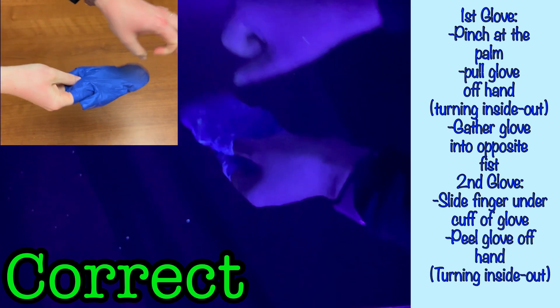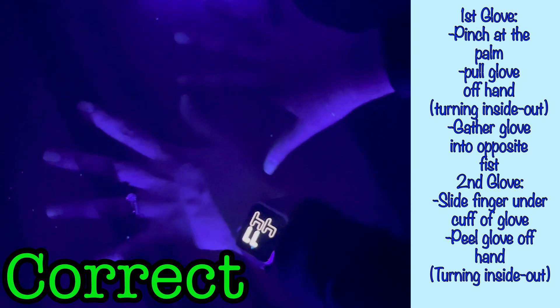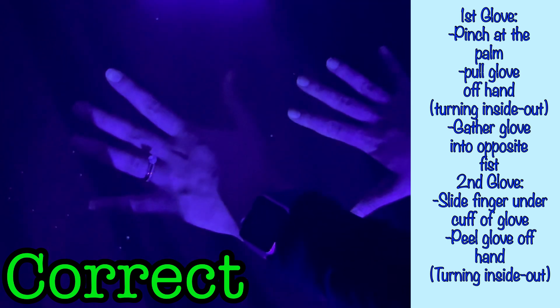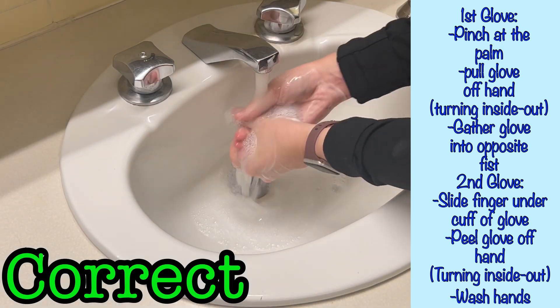Then gently peel the glove off of the hand, turning the glove inside out in the process. By removing in this method, you have contained the first glove inside the second, and the only exposed surface of either of the gloves is the uncontaminated inner surface of the second glove. You can now handle this glove with minimal risk of contamination and dispose of it in the garbage. When doffed properly, you will be able to avoid contaminating your hands with anything present on the outer surface of the gloves. But even when doffed perfectly, you should always be washing or disinfecting your hands following the removal of gloves.